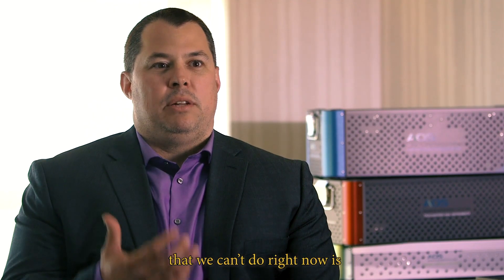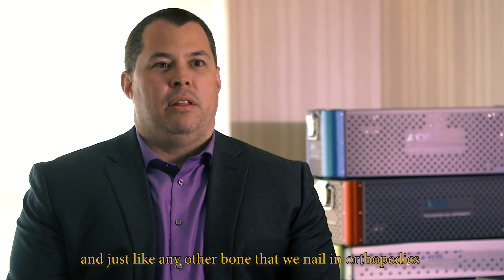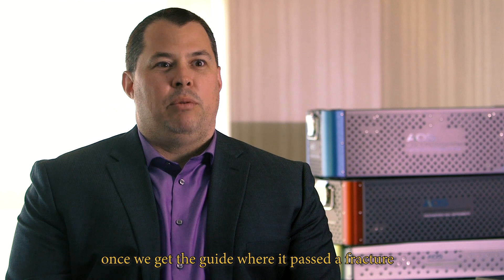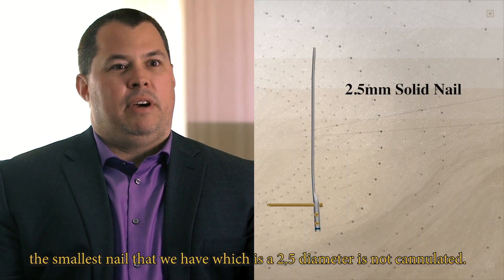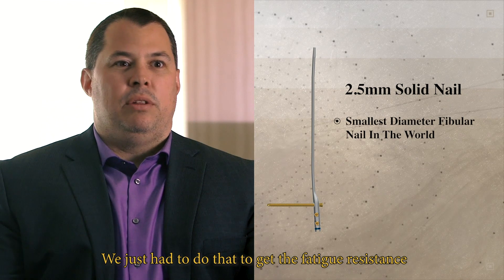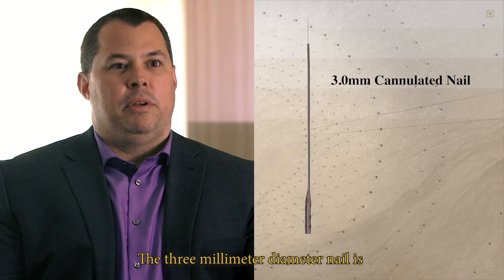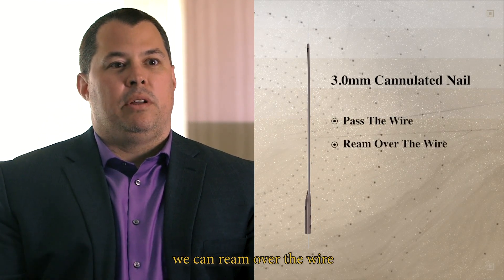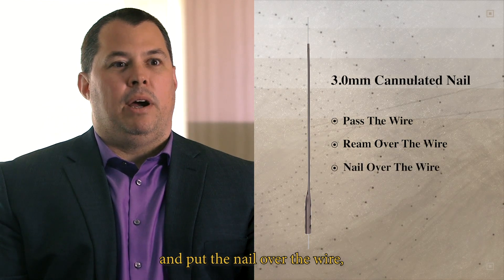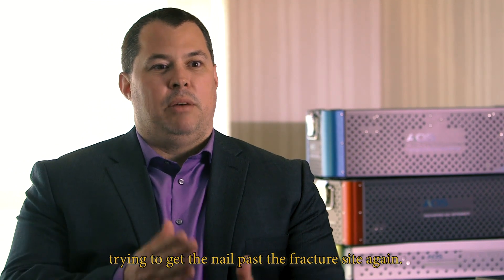One other area the market can't address right now is having a cannulated nail. Just like any other bone that we nail in orthopedics, once we get the guide wire past a fracture, the last thing we want to do is remove it before putting the nail in. The 2.5mm diameter nail is not cannulated — we had to do that to achieve sufficient fatigue resistance at that small diameter. The 3mm diameter nail is completely cannulated, so we can pass the wire, ream over the wire, and put the nail over the wire without spending extra time getting the nail past the fracture site again.